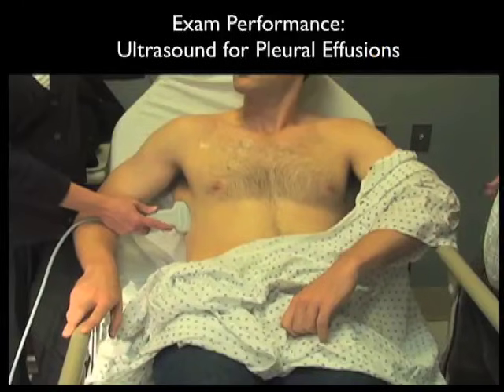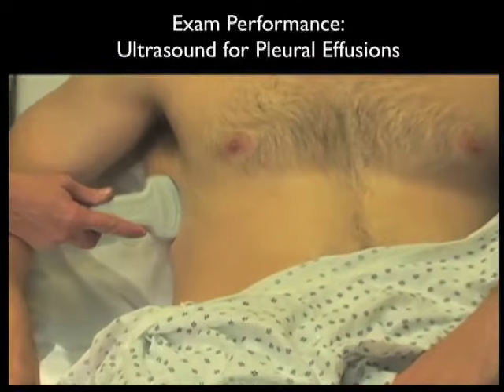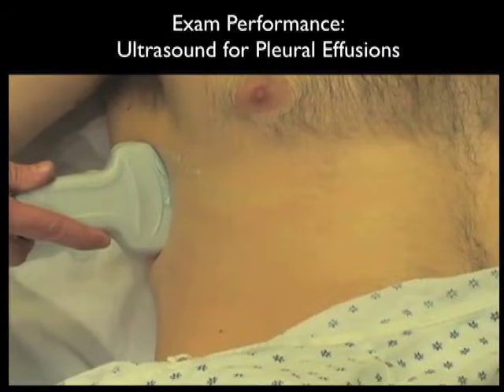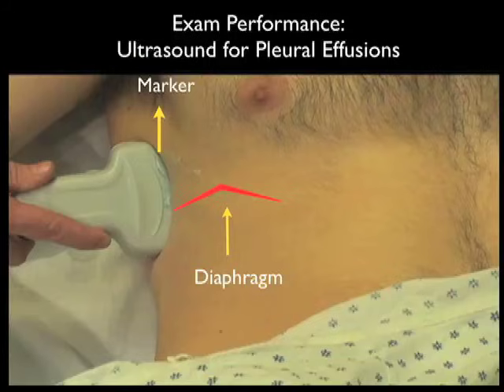Before performance of a thoracentesis procedure, it's mandatory to look with sonography to make sure that there's enough pleural fluid amenable for a safe thoracentesis. Notice here we have the patient positioned in an upright position so that the fluid will layer out above the level of the diaphragm. Notice here we note the diaphragm as shown by the red line across the patient's anterior chest wall. Notice here we have the probe positioned along the lateral aspect of the patient's chest with a marker dot towards the patient's head.